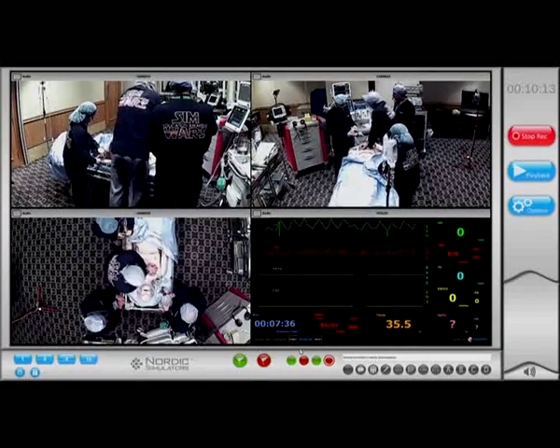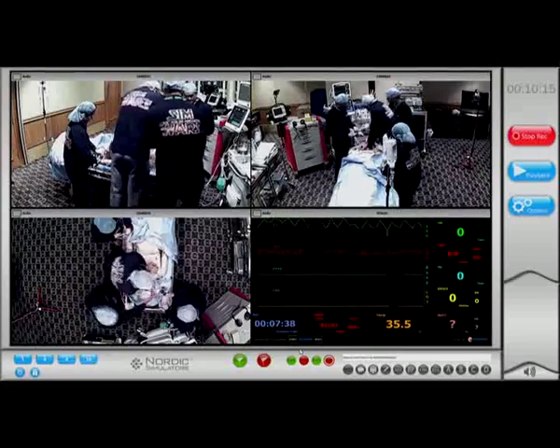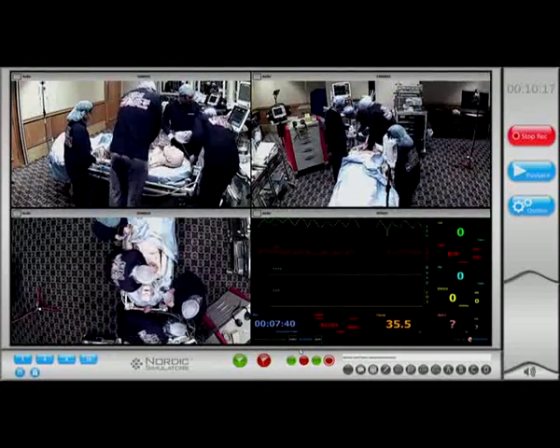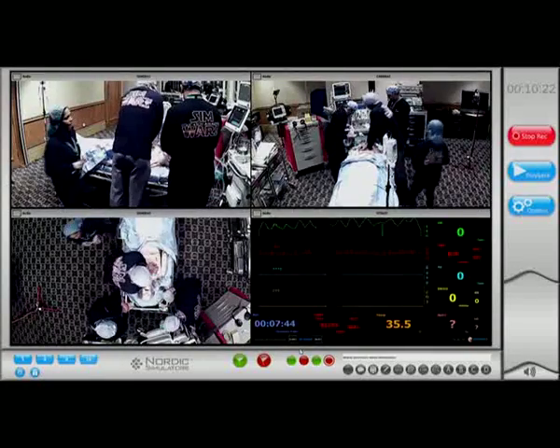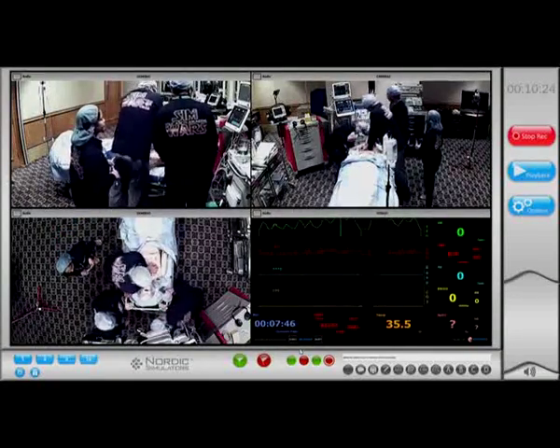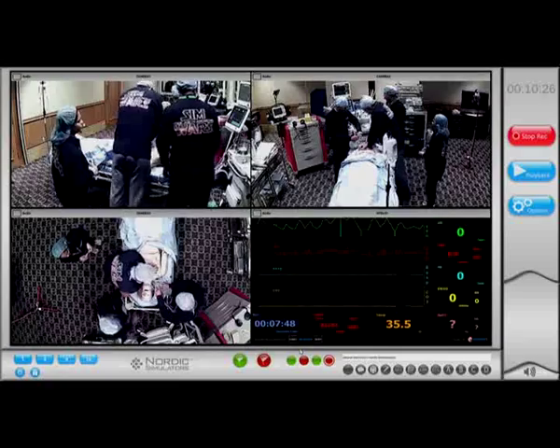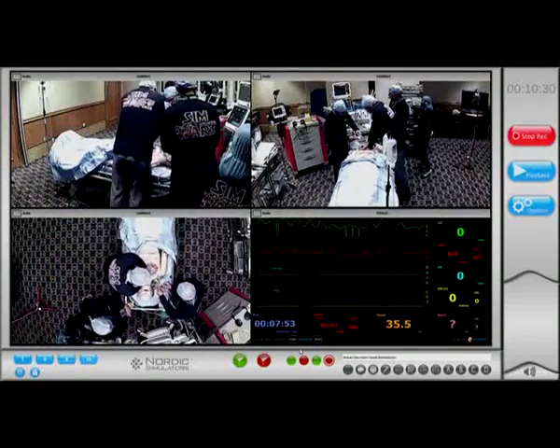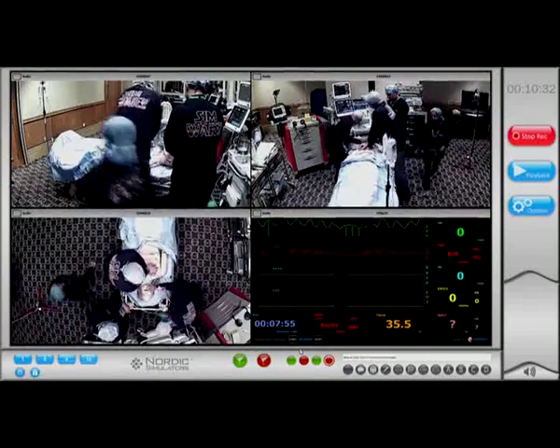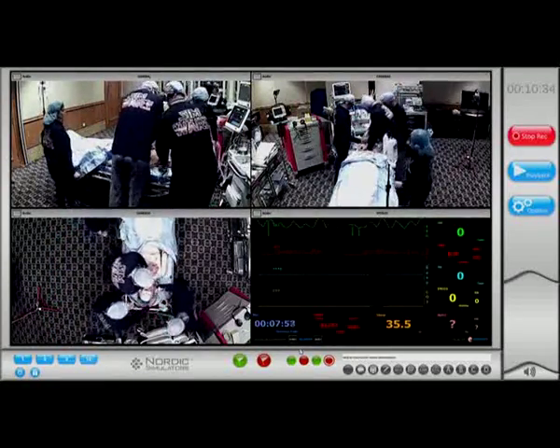Okay, capnography connected, Ahmed? It's connected, Dr. Yasser. Did you note the time, Ahmed? Notify me after 2 minutes, please. Do you want to fix the tube? Yes, please. It's okay, sir.